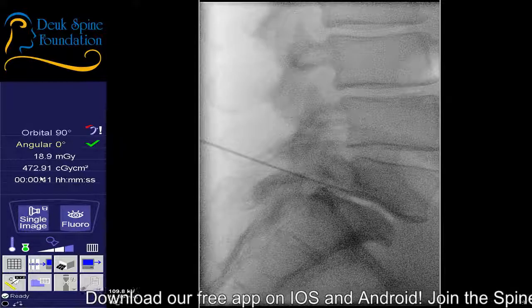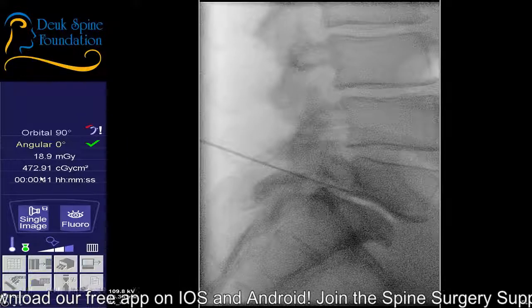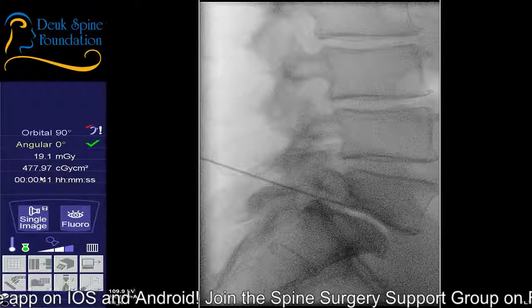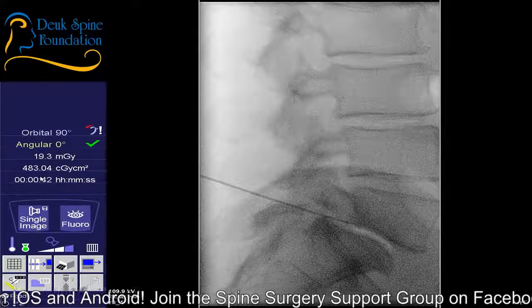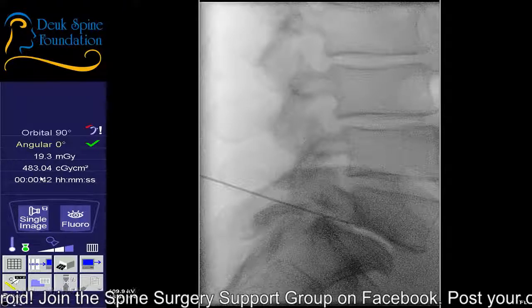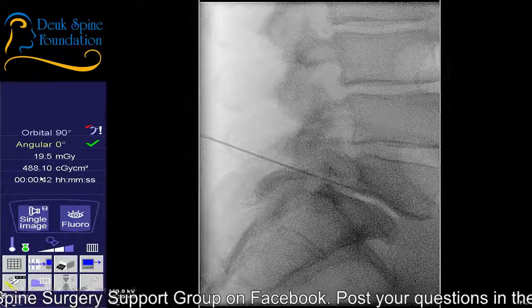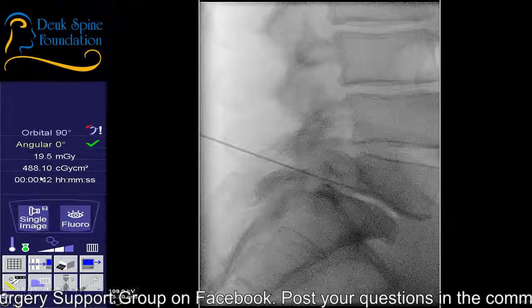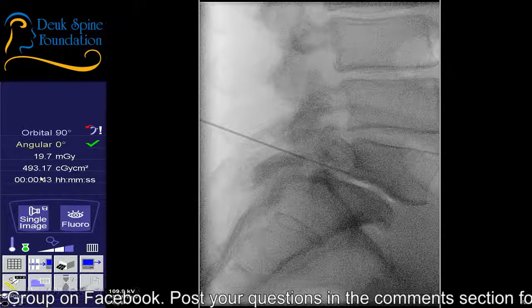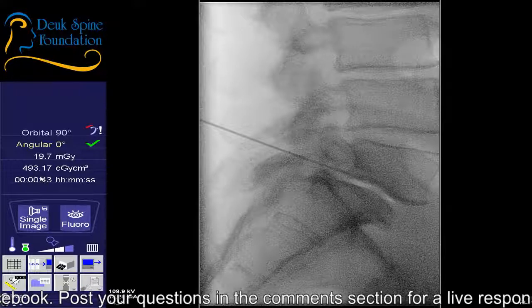All right. Let's take the wag. Release it. Shot.